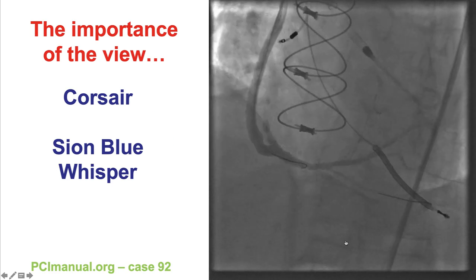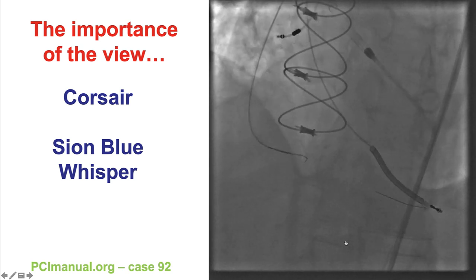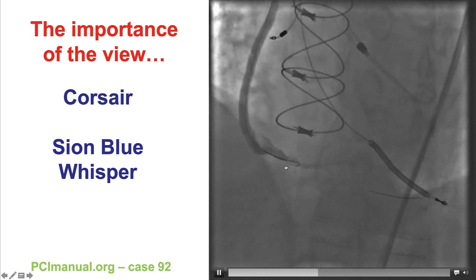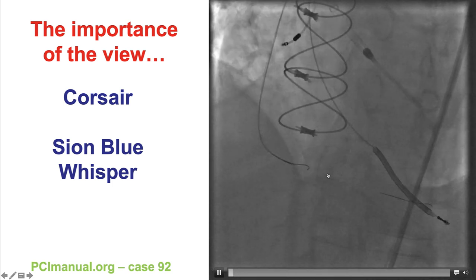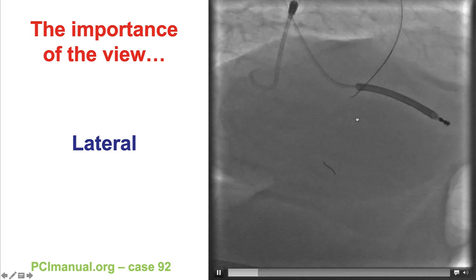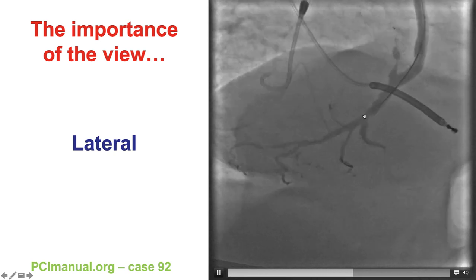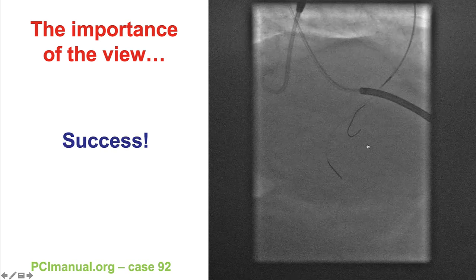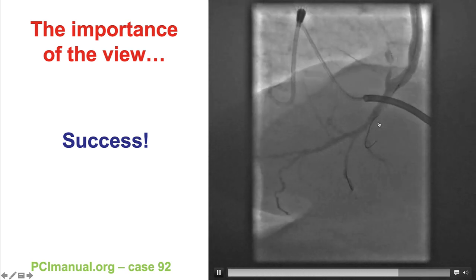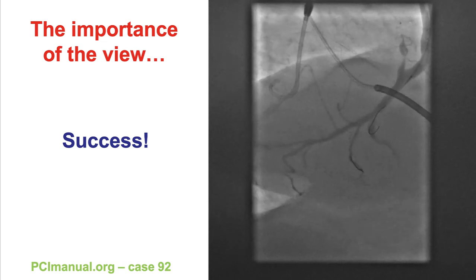Before going over these techniques, it is important to discuss the view used for wiring. This is an example of a case in which wiring of the PDA was challenging in the LAO cranial view. However, once we used a lateral view, the origin of the PDA was much easier to appreciate, and that helped direct the same guide wires into the PDA. Using different views that open up the bifurcation or area of tortuosity can be very useful.